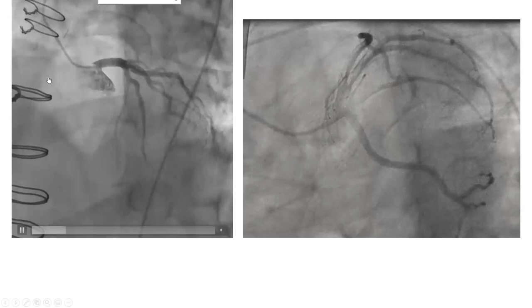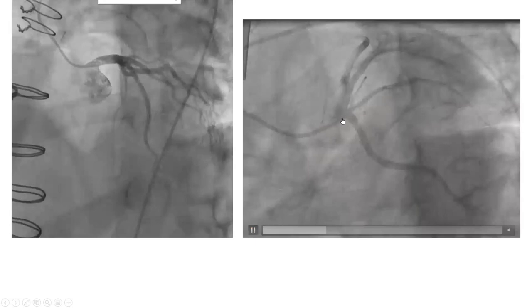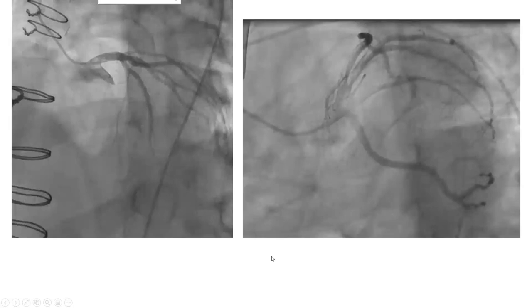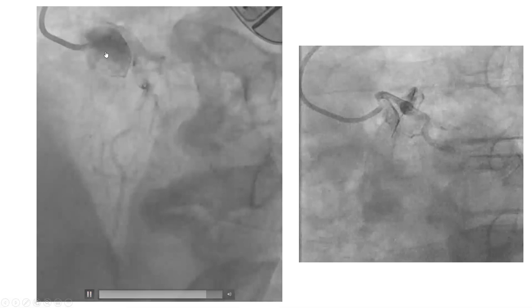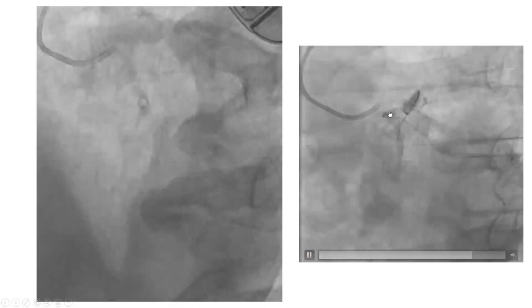Here is an example. See how the LAO cranial opens the ostium very well, delineated as one line with the cusp. Whereas LAO caudal overlays contrast spilling into the cusp over the ostium and does not allow proper osteal delineation. In another example, LAO cranial gives very good delineation of severe osteal disease in this patient. In yet another view — LAO straight — again, great delineation of the osteal disease.